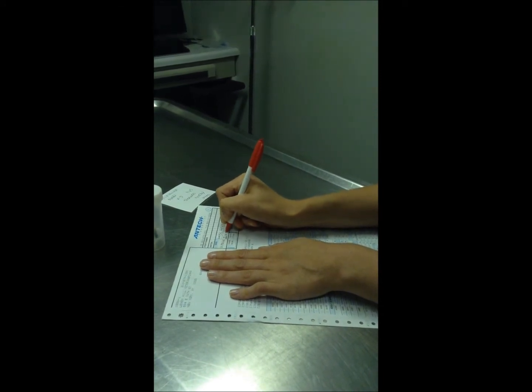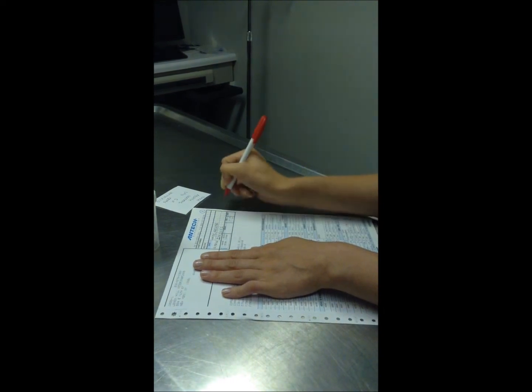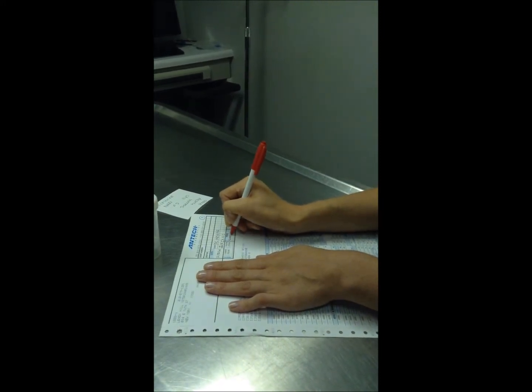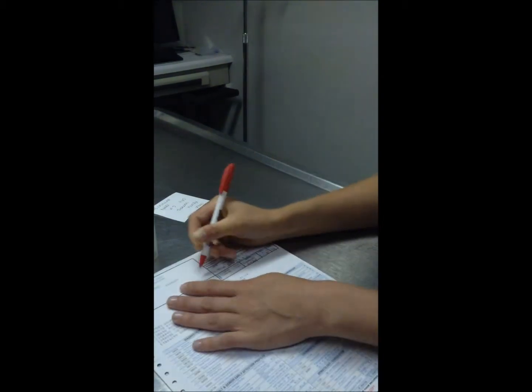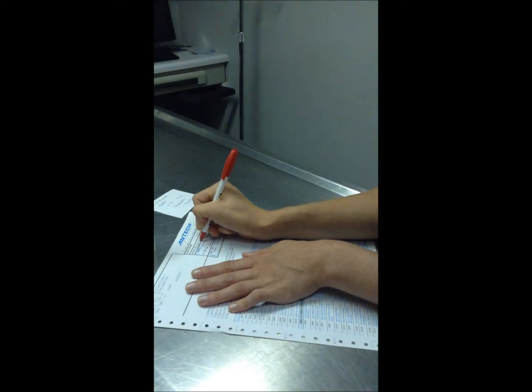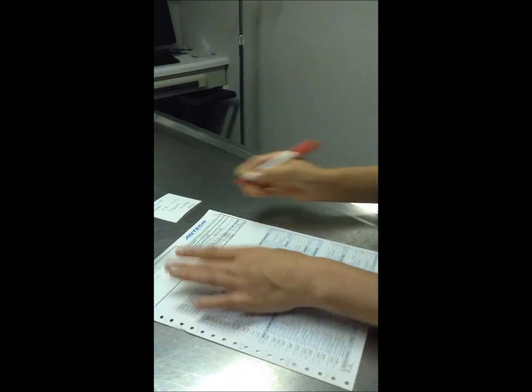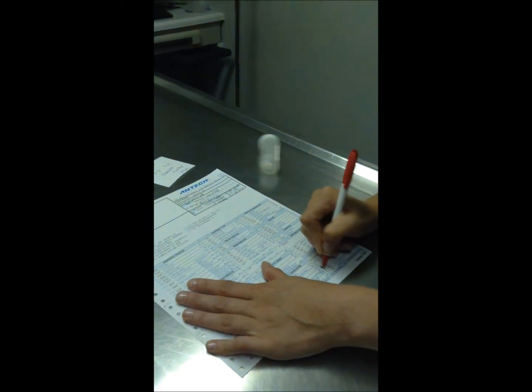And then after we're done doing this, we're going to stick it in the bag and it goes in the fridge until the lab actually picks the test up. You always put the doctor's name that is ordering the test, so when it comes back you know whose patient it is, and then you always mark the test that you're going to be running.